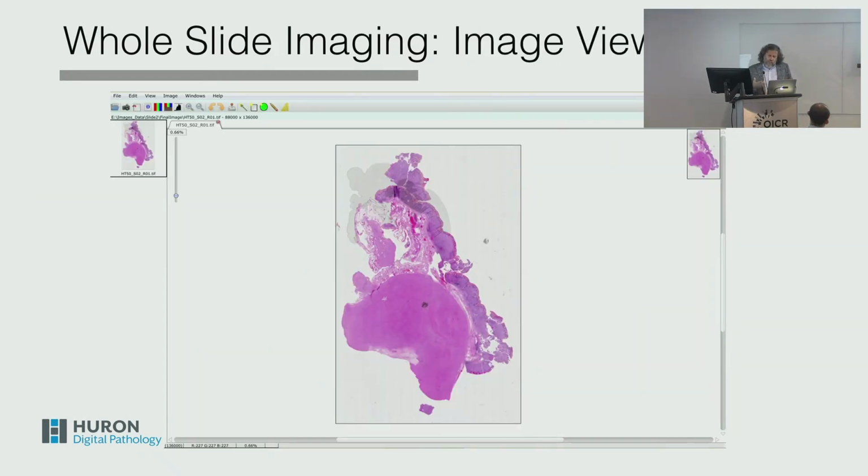And after you get an image, then you have some sort of image viewer, image management system, then you can do the usual stuff. This is where it gets really interesting, because now the tissue, the specimen, is in the computer. Now the entire repository of computer vision and more recently artificial intelligence is available. Now we can do really nice things with the image, and hopefully we can take some of those laborious tasks that we should not assign to the pathologist, take them away and assign them to computers.